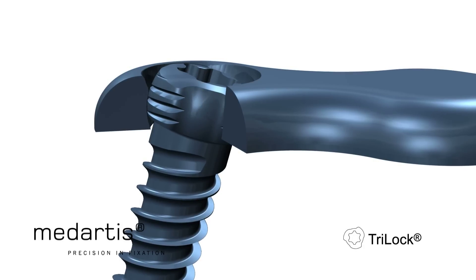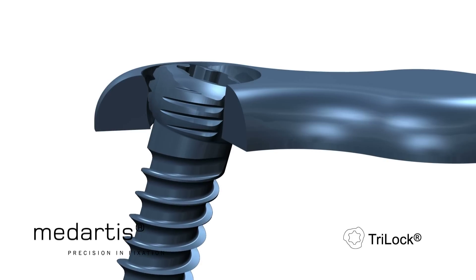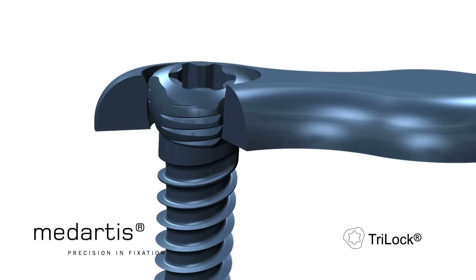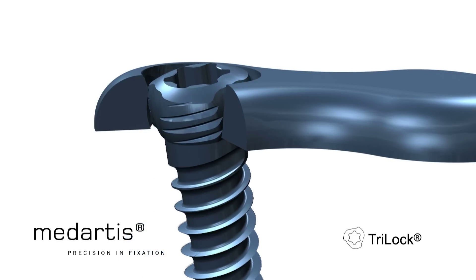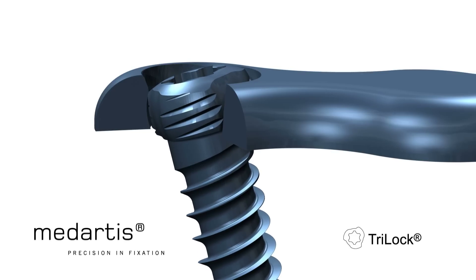The absence of a thread carries the additional advantage that the screw can be unlocked and relocked at a new angle up to three times without losing stability. This fact allows intraoperative adaptations of angles and vernier adjustment.